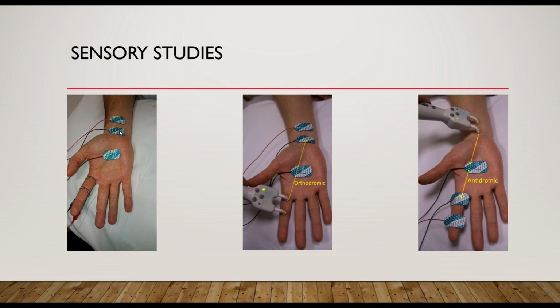Now, you can actually stimulate and record in either direction. In this particular setup, these ring electrodes are being used to stimulate, and these pads are being used to record. The pad in the middle is the ground, making the patient electrically neutral to the machine. The reason that we need two electrodes is to spread the current from one to the other, to generate those currents going forward.